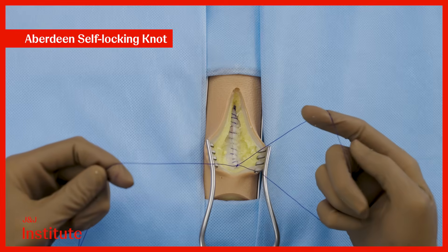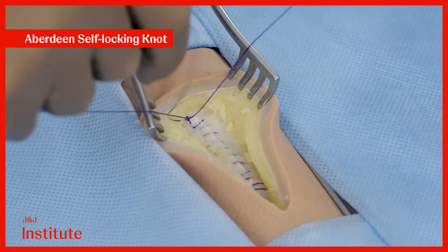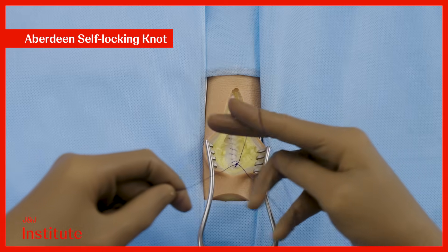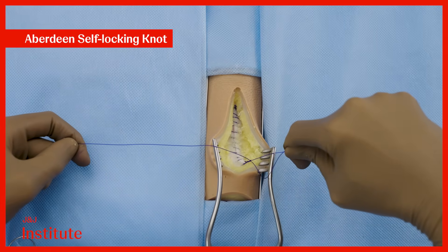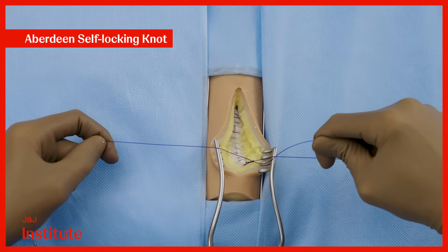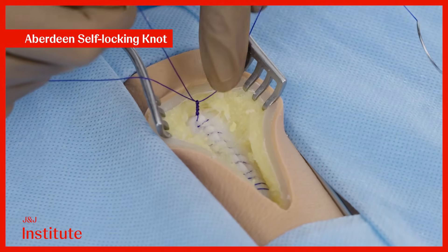It may not be fully snug during the initial pass, so repeat this process at least 4 to 5 times, threading the long thread through the loop to form a new loop. With each repetition, apply traction with your ring and little fingers to tighten the knot and ensure that you have a snugly sitting knot. You can use your left hand to further tighten it as necessary.